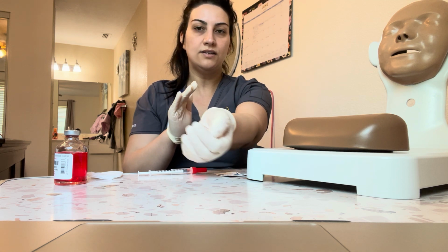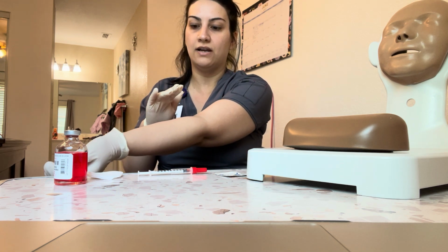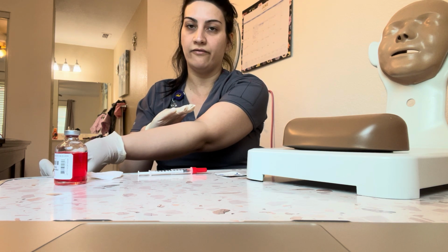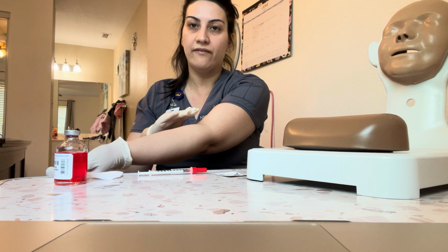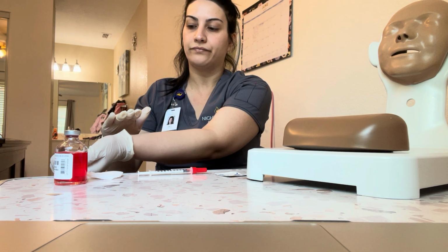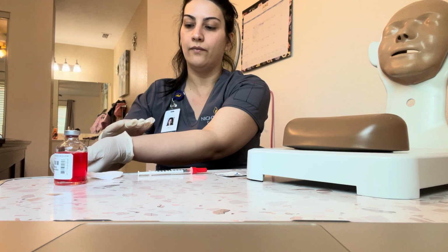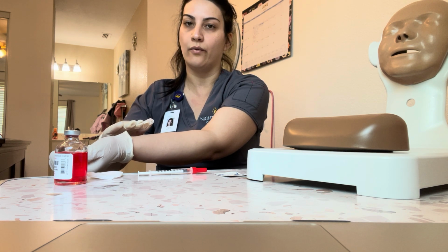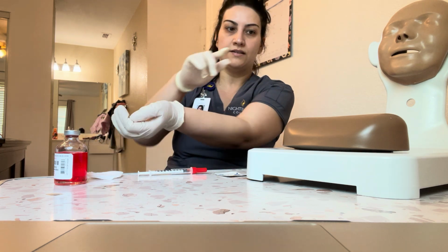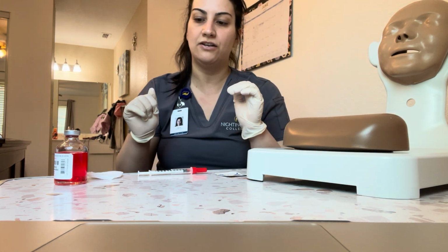So it's going to be 3 to 4 fingers below the antecubital space, and 1 hand length above the wrist. So it's going to be in this area, right there for my patient.